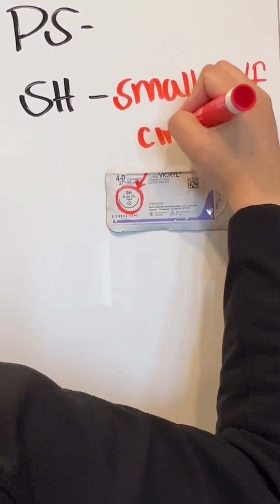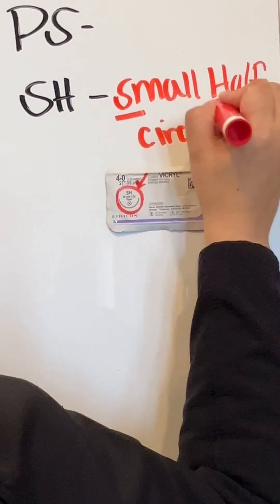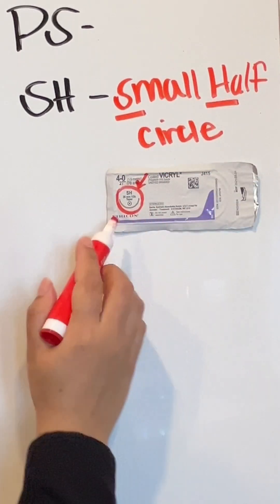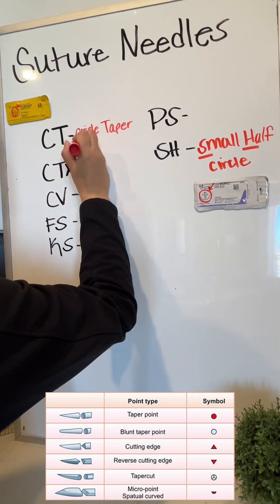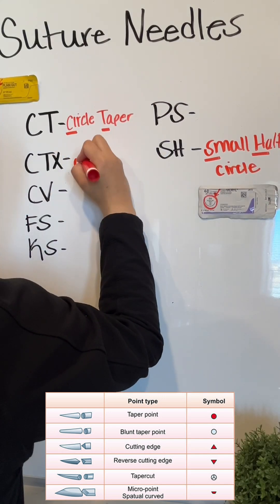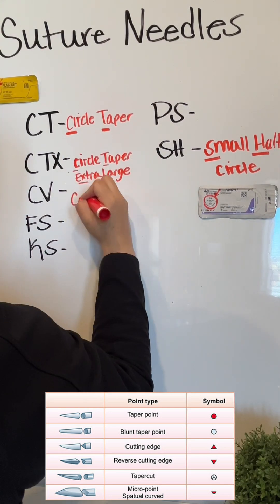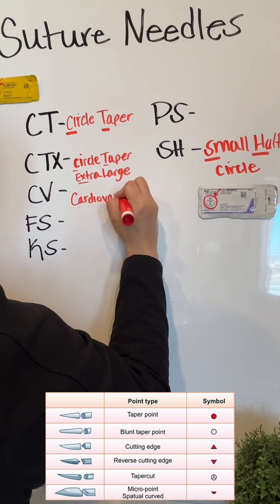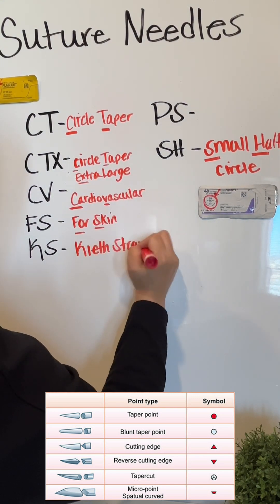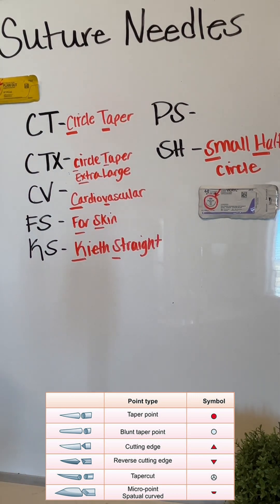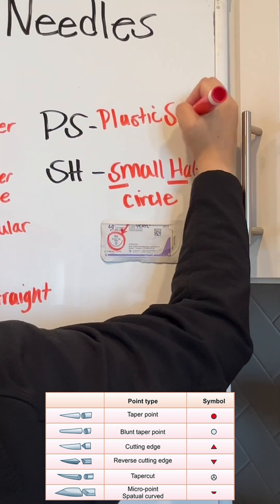Here you can see a 4-0 vicryl on a SH. SH stands for small half circle. These are going to be some common needles you will see when you are first starting out. You have a circle tapered needle, a circle tapered needle extra large. There's also a Keith needle that we'll see here in just a sec. A popular needle that you will see often is a PS2, typically for skin.